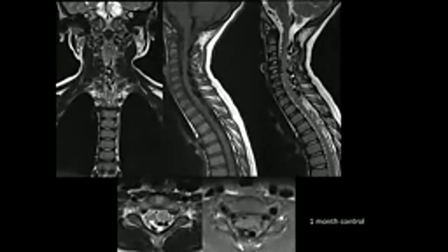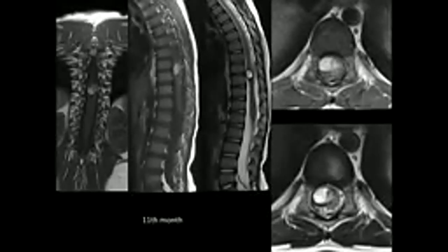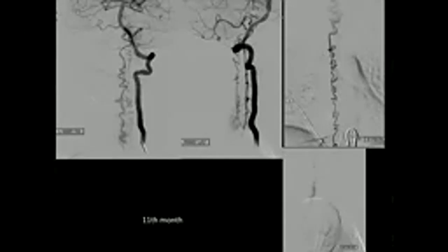And this is the 1 month follow-up. The lower portion is gone, and he still had a fistula but no venous edema, and we don't want to touch that fistula, leave it alone and follow the patient. And this is the lower part. Again, this is almost a year follow-up. See the anterior spinal artery arising from the vertebral V4 segment going down.